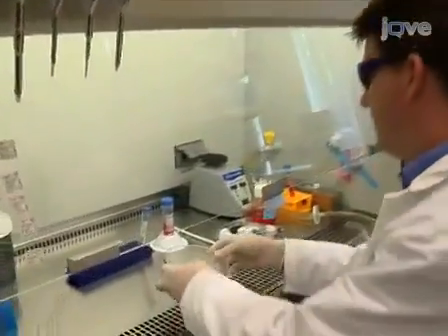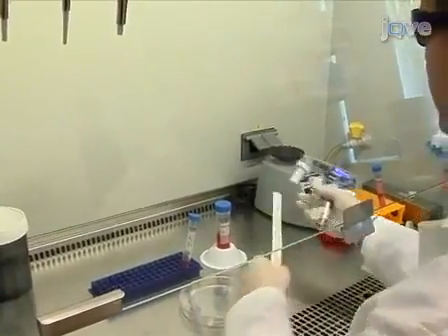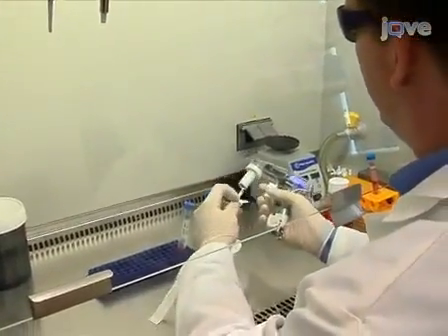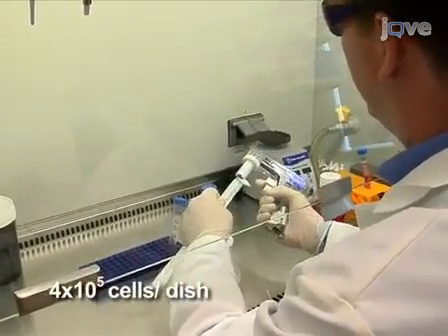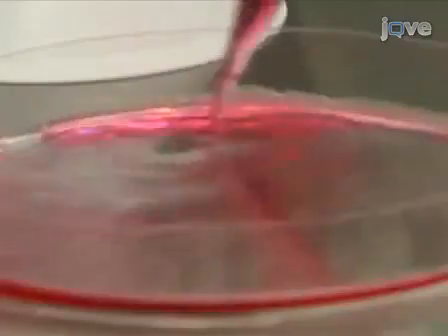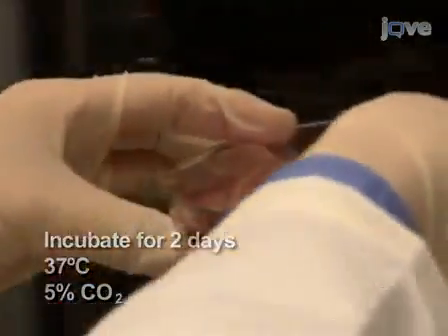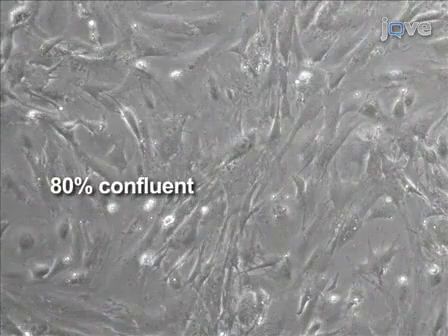Begin by seeding mouse embryonic fibroblast or MEF cells onto a 15 cm gelatin-coated dish at a density of 4 × 10⁵ cells per dish. Now add 30 milliliters of MEF growth medium and incubate the cells for 2 days at 37 degrees Celsius and 5% carbon dioxide until they are approximately 80% confluent.